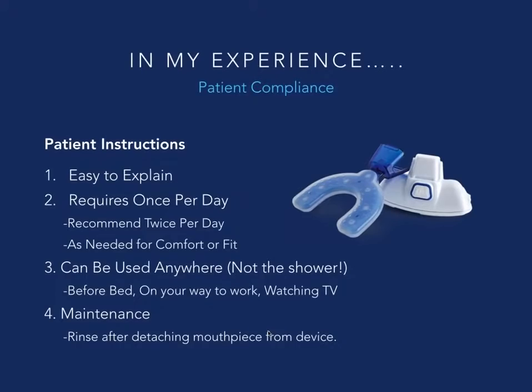You can definitely use it before bed. Obviously, it's a fantastic time for our patients to do that, or watching TV or driving to work. Those are great ones. So the maintenance of it, very easy. Just rinse and detach that mouthpiece that comes off there for the patient.